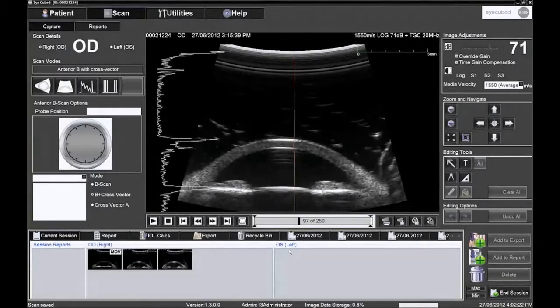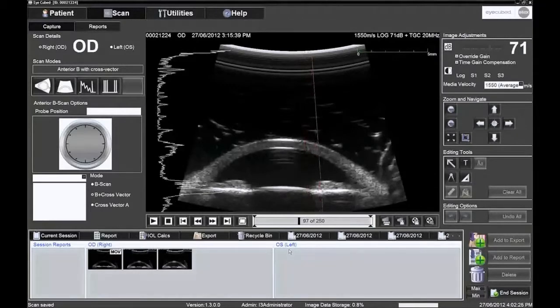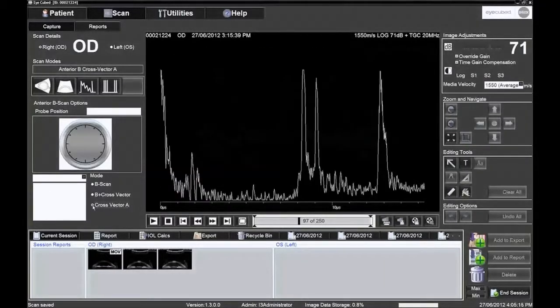It is possible to add a vector to the B mode image. The vector can be positioned anywhere on the image, and displays one of the 250 scanning lines as an A scan. This line can help ascertain if the scan is really along the optical axis, and therefore perfectly centred. The operator observes if the two corneal echoes and the two lens echoes are at their maximum and equally high. This A scan can also be displayed on its own, with a microsecond scale to measure distance as a function of time.